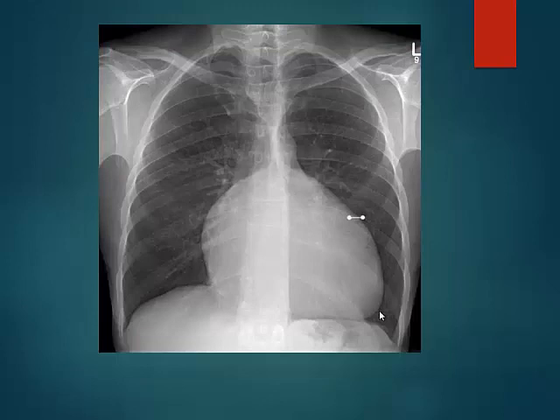Okay, this patient, a young female. So there is again a prominent left heart border, right ventricular enlargement. First of all, the overall heart size is much enlarged, much dilated. Then there is the prominent convexity of the left heart border, indicating right ventricular dilatation. And this one, right atrium dilatation. So if you see both right atrial and right ventricular dilatation, which conditions would come to your mind?